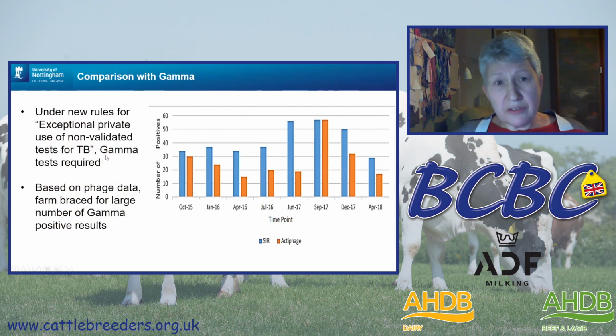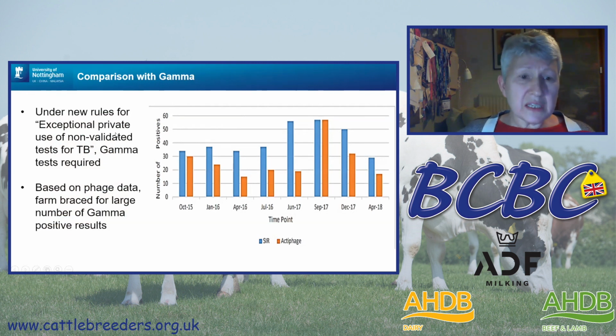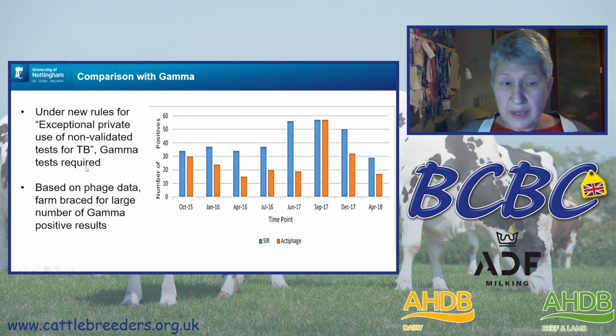So just to complete the story of this study, after the negotiations and the resampling, DEFRA asked for gamma tests to be carried out, because under the use of non-validated tests in the UK for private use testing, regulated by DEFRA, you need to have done a gamma test before you're allowed to use anything like Actiphage. So retrospectively, these rules had come in and they asked us to do a gamma test. And obviously, based on the phage test, the farm was really braced for a high number of positive gamma results.